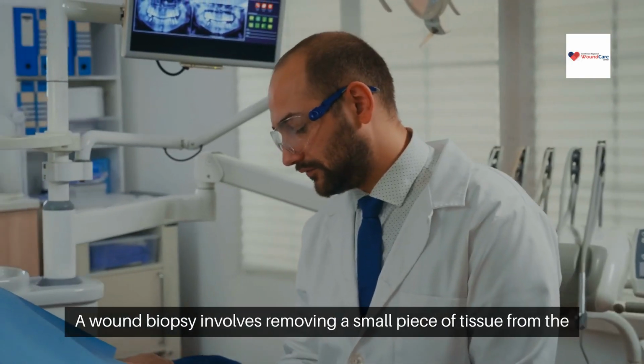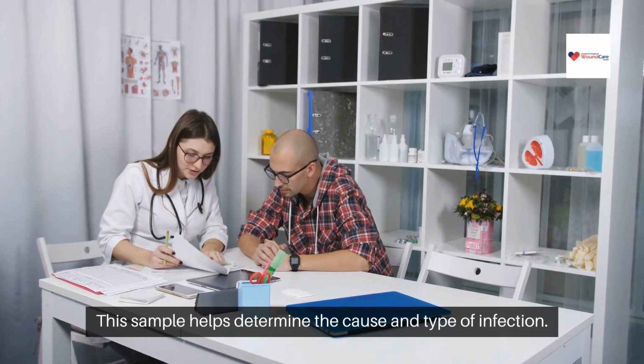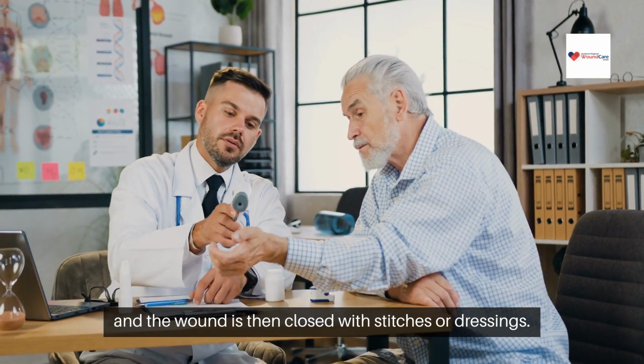A wound biopsy involves removing a small piece of tissue from the wound. This sample helps determine the cause and type of infection. The procedure is done with biopsy forceps, and the wound is then closed with stitches or dressings.